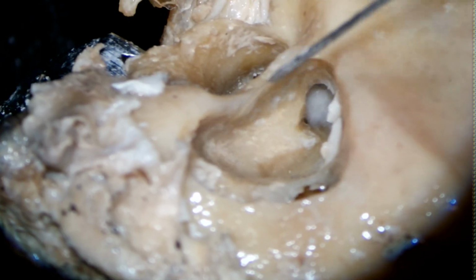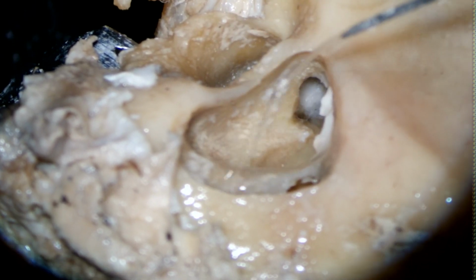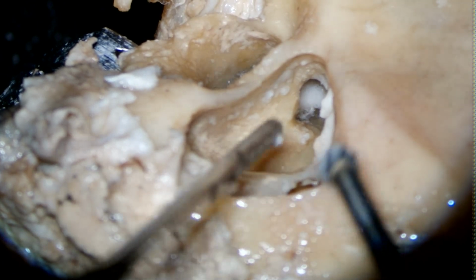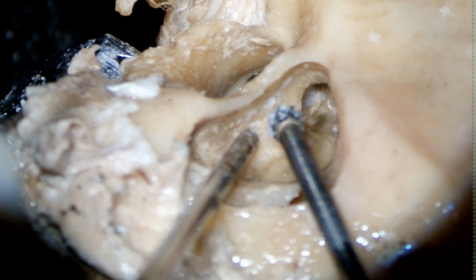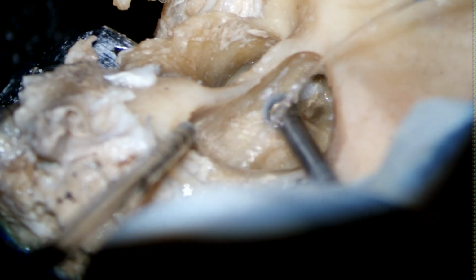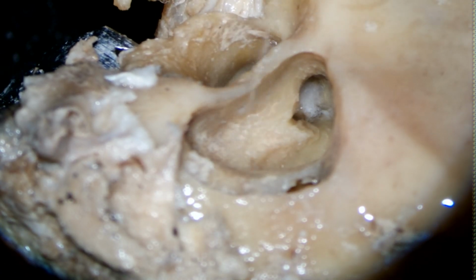Okay. So can we enlarge it? Actually there is no bone in this, sir. The incus is absent here. So I need a smaller burr.